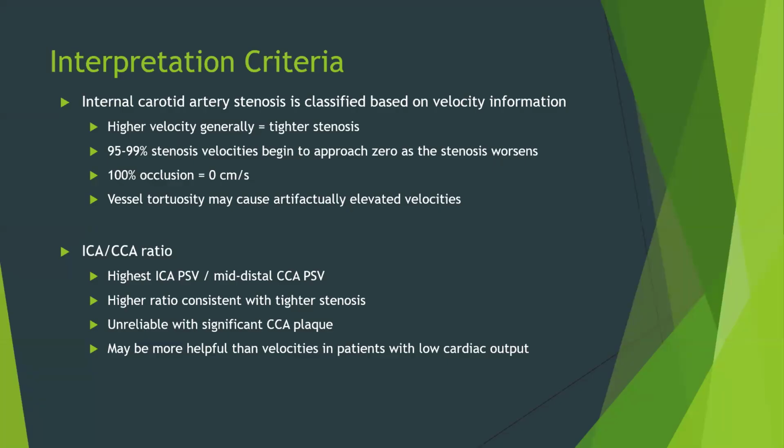Vessel tortuosity may cause artifactually elevated velocities as well. I don't know if you guys remember when Leah had that tortuous carotid artery on our screen, right? But on those areas of the turning points, that's where there's going to be some higher velocities.